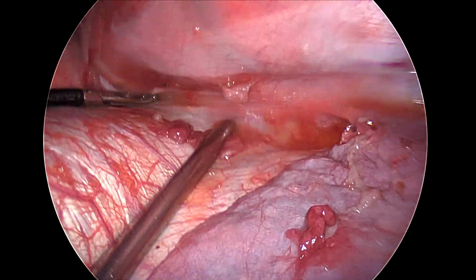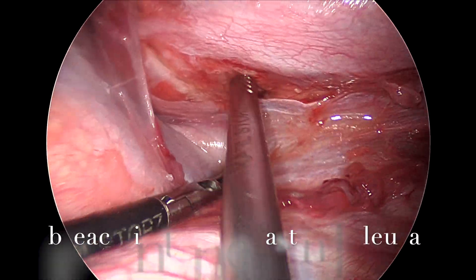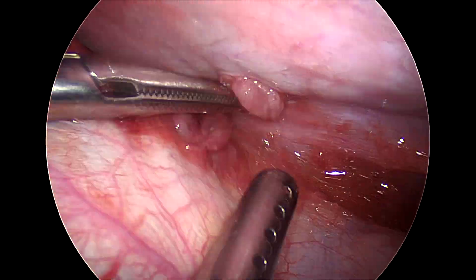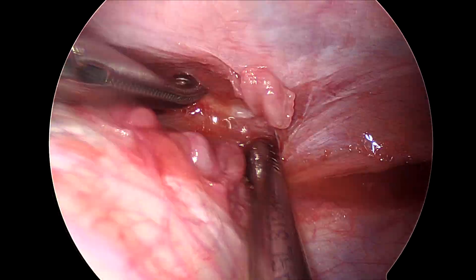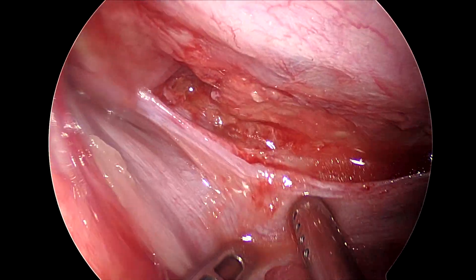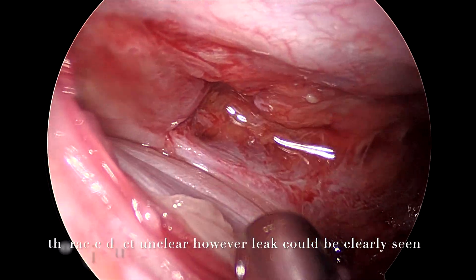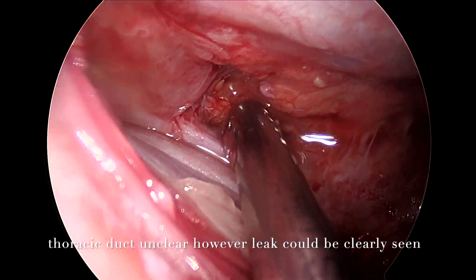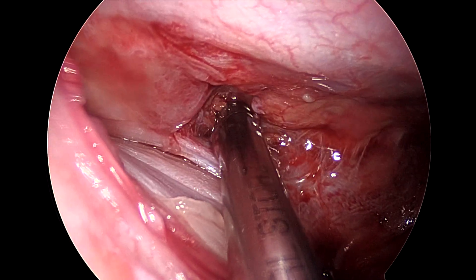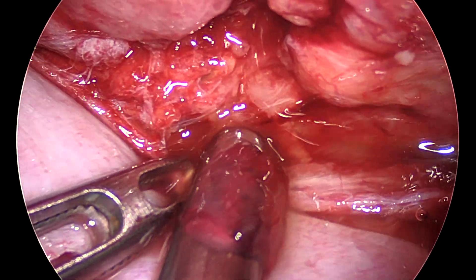At this level we can see that there is a breach in the mediastinal pleura, indicating the site of injury. There was some fluid seeping out from that area. However, the thoracic duct could not be clearly seen. This appears to be the area of leak — at this point we can see an opening from where the fluid is leaking out.